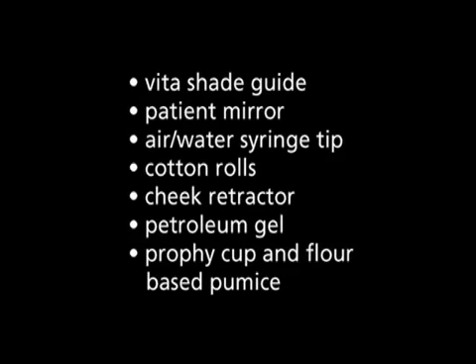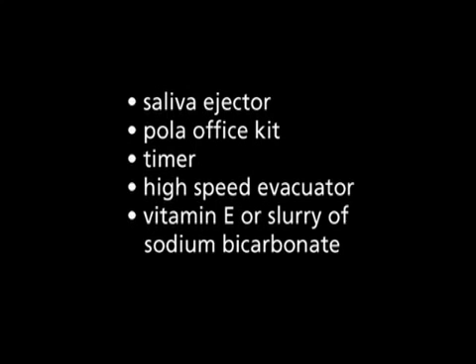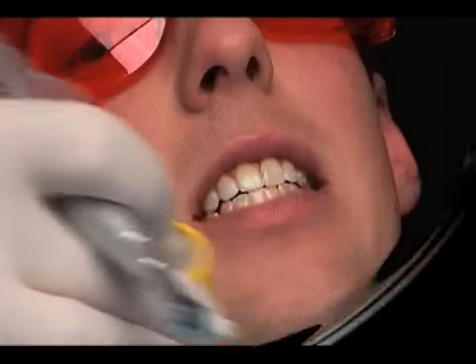Assemble all of the material you will need for the whitening procedure, including Vita shade guide, patient mirror, air water syringe tip, cotton rolls, cheek retractor, petroleum gel, Prophy cup and flour-based pumice, saliva ejector, Pola Office kit, timer, high-speed evacuator, vitamin E or slurry of sodium bicarbonate.